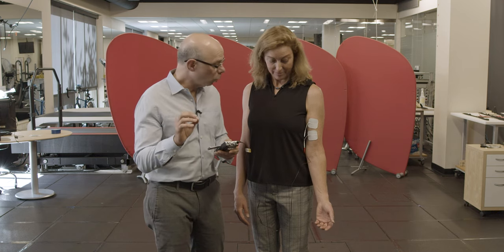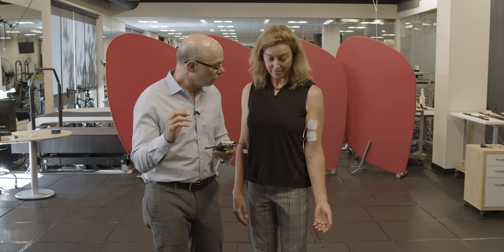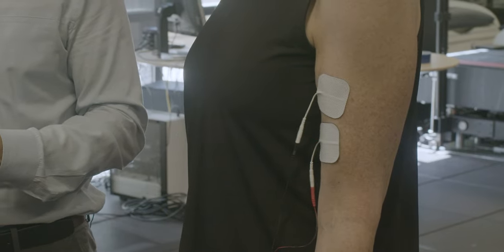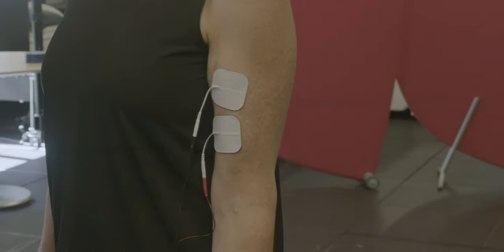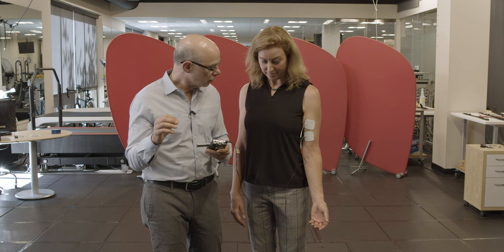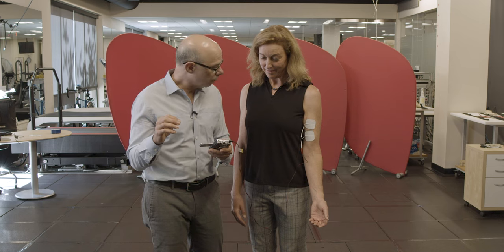Now we saw in lecture that as you increase frequency, we'll get more frequent twitches. But we'll also begin to see that we get more force at higher frequencies. I'm moving up in frequency — you can see that her muscle is twitching even more. Now we're at seven hertz. Going up to get a fused tetanus. It's still twitching a little bit. I'm now up at 20 hertz.